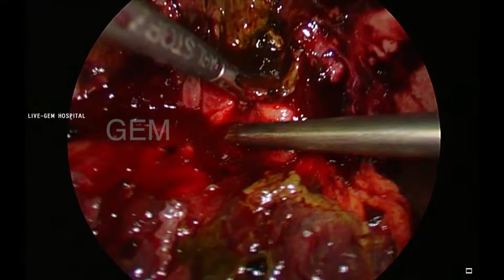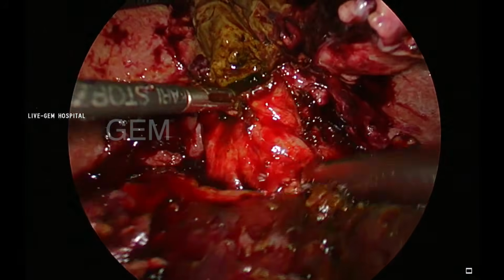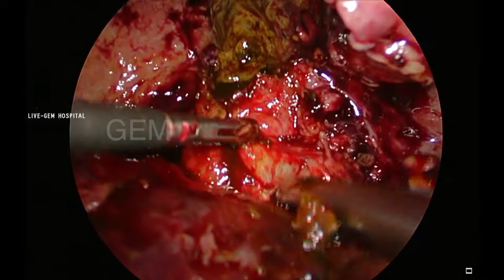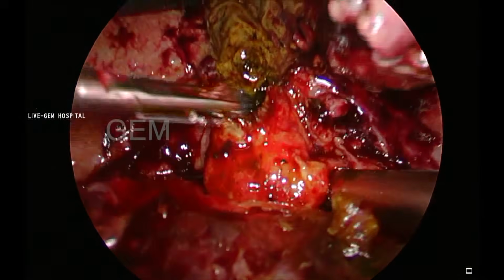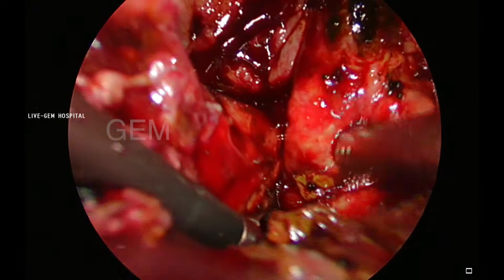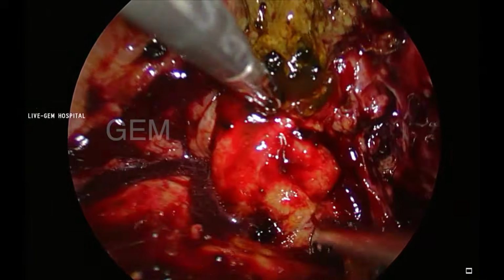So it is a very wide infundibulum. I am trying to mobilize the infundibulum so that I can see the cystic duct and clip it. There also you can see the impending perforation.